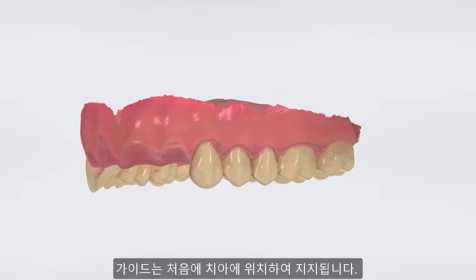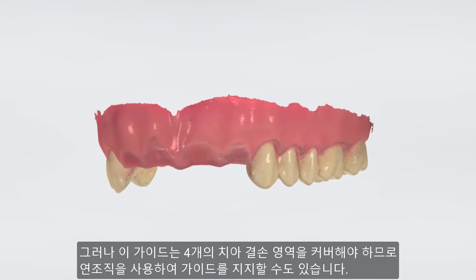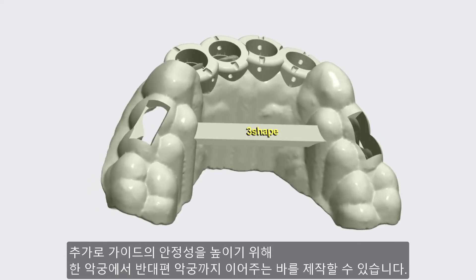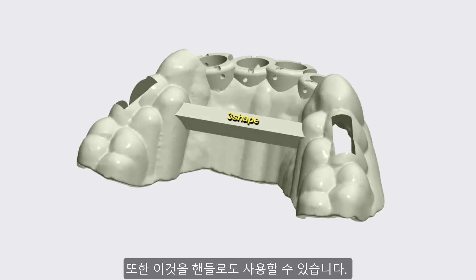Initially, the guide will be placed on the teeth, but as this guide covers a four-teeth gap, we can also use the soft tissue for support. Remember the possibility to position a bar going from one side of the jaw to the other to further increase the stability and also use it as a handle.